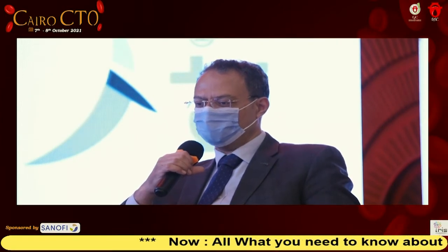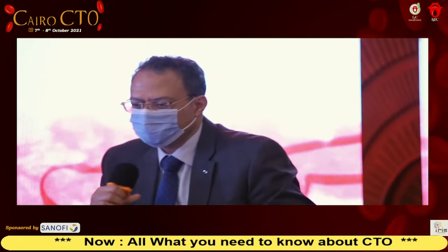It's very important to assess where the retrograde wire is. There is a point I did not actually mention in my talk. The problem with failing to connect the wires, regardless of whether you're subintimal or intimal, is that, like we all know, if you have a true lumen retrograde and subintimal antegrade, that is the highest failure rate of reverse CART. The best option is to actually have both antegrade and retrograde in the subintimal.